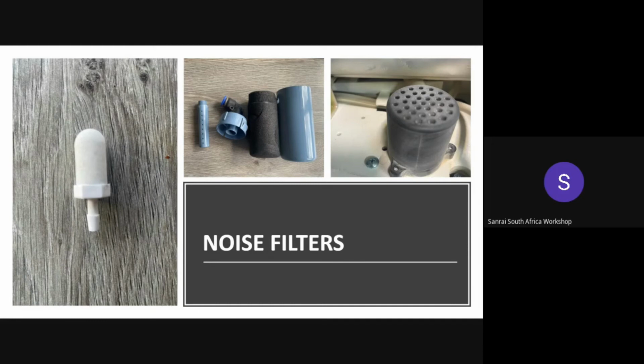So in conclusion to today's topic on filters, it is very important for us technicians and field technicians to always remind the users of these machines and also the operators of the importance of the filters.